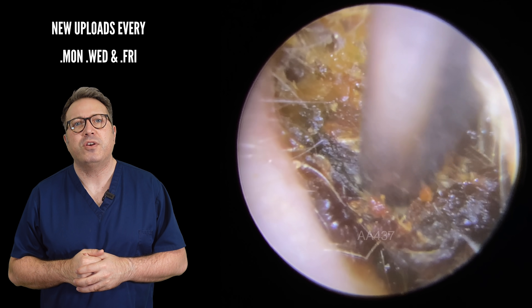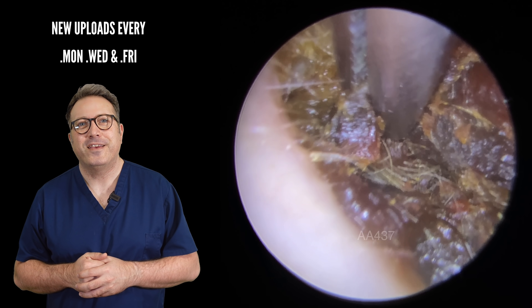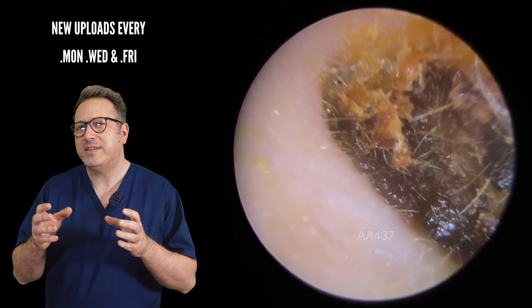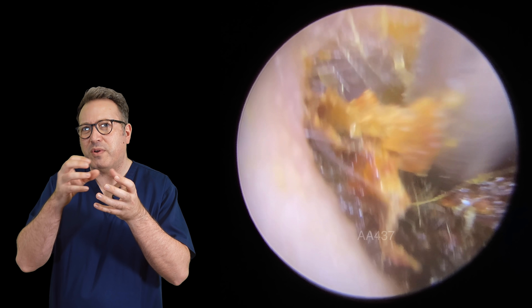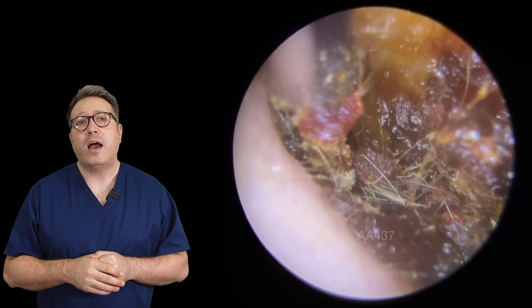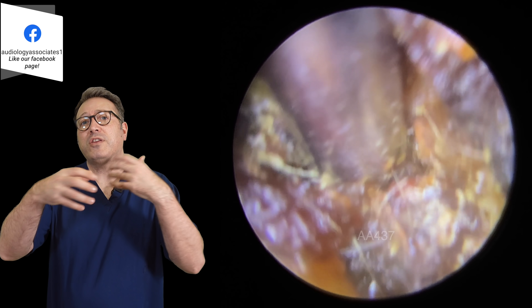So we're just pulling this down from the top — that's not really budging. We're going to put the crocodile forceps in. It's always difficult with skin because crocodile forceps will give you a fantastic grip. The difficulty is if the skin is quite solid with a lot of structure, it'll help you pull it out, but if it's a little bit thinner, as you get the grip it tends to tear through that piece of dead skin. A lot of patients ask what this feels like — in the majority of cases it's just going to feel like a pulling sensation, not painful at all.